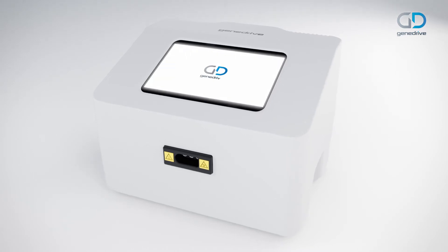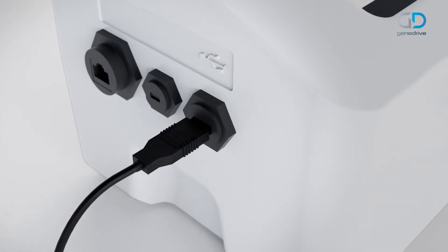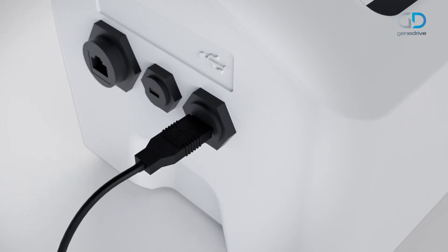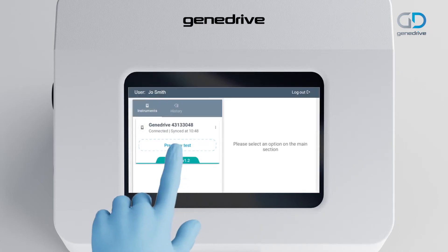Switch on the GeneDrive system. When using a printer, connect it to the USB 2 port of the GeneDrive system. Then log in to your unique user account using your barcode or institutional access.